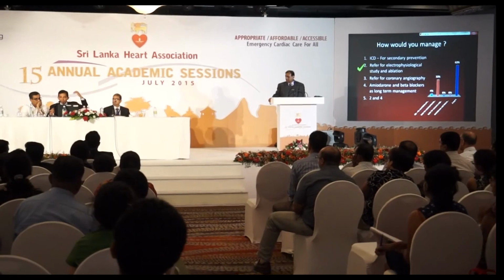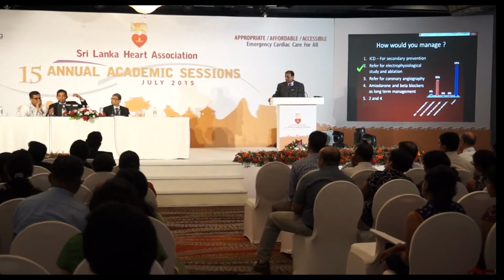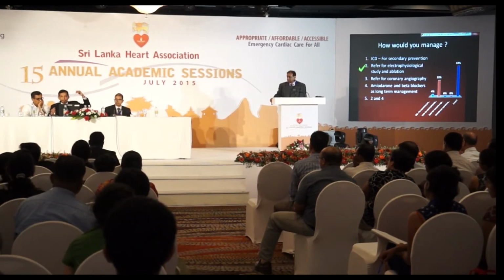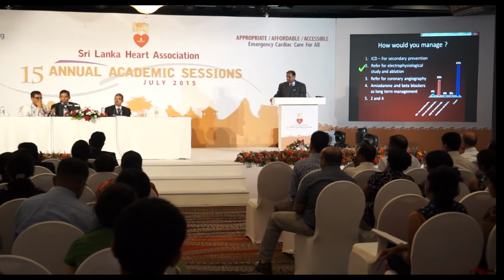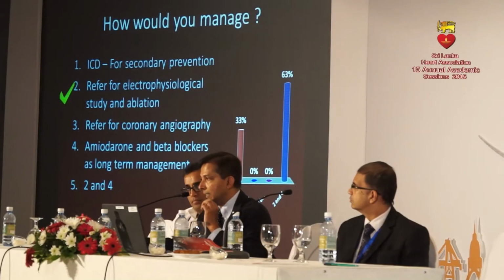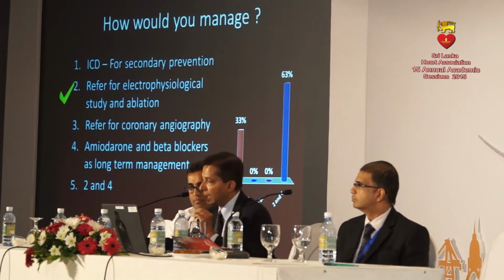You can have a rapid conduction through the pathway, and I mentioned that yesterday in my talk. Some pathways are what I call wimpy, they don't conduct rapidly, then you are safer. But when it goes this rapid, it takes a second only to convert atrial fibrillation to ventricular fibrillation, and you can have any young person with a normal strong heart dying then and there. And that's entirely curable. There are very few things in life, whether in cardiology or elsewhere, we cure so, thankfully. I think, no question, send the patient to the electrophysiologist.